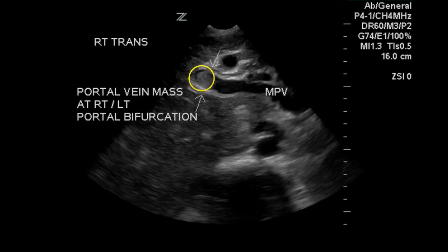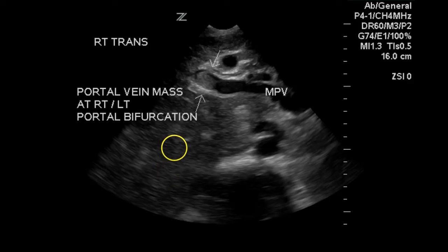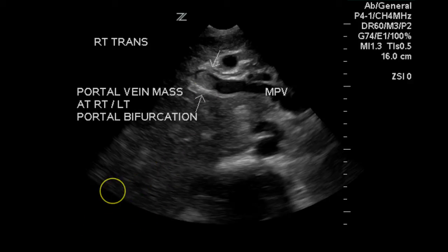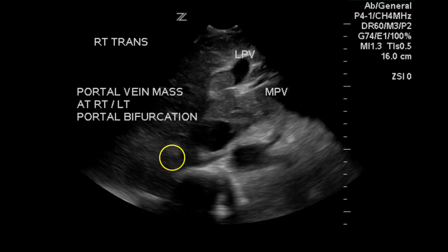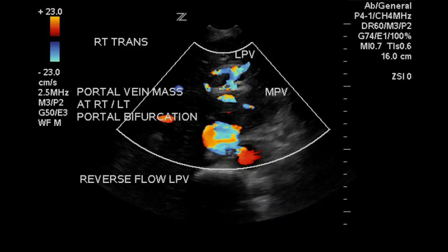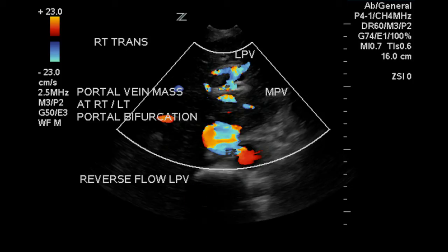We can see some more solid material in the portal vein just at the confluence of the right and left portal veins, and more material again in the left portal vein. Again, there is no flow in this material, indicating that it is less likely to be tumor and more likely to be thrombus.